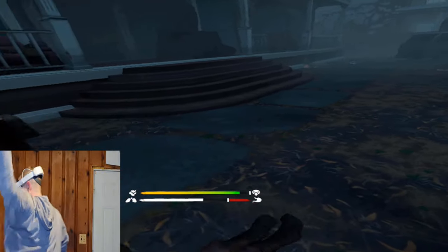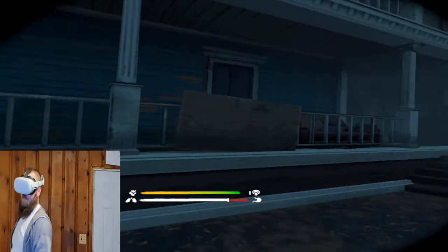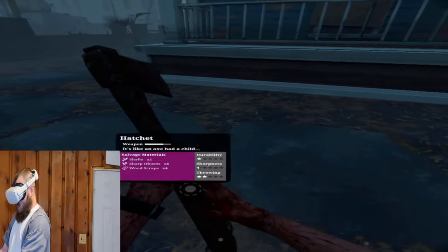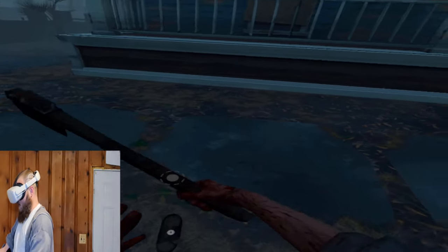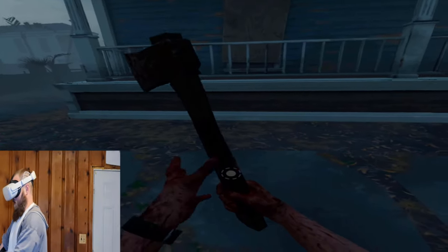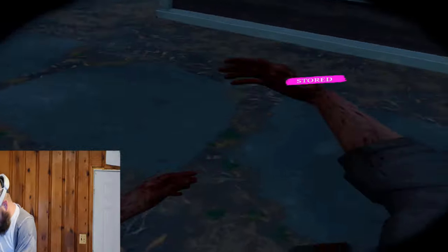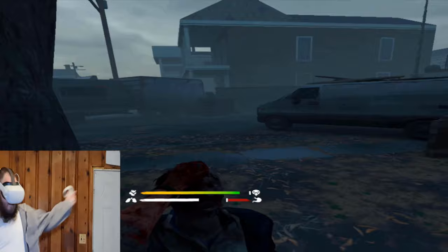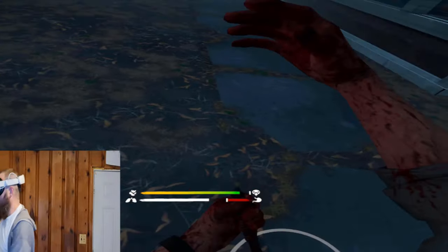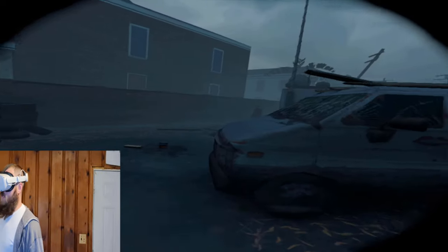One thing to remember: the electric hand sometimes keeps opening and closing after you grab hold of something. To stop that, you need to turn the hand off. That's also the way that I reload the guns — I just use my good arm with the guns if I get an opportunity to.